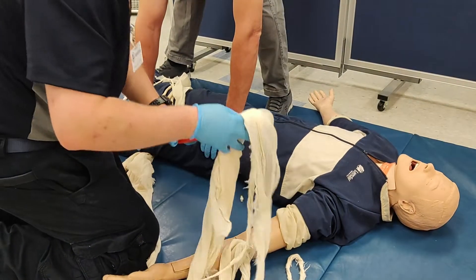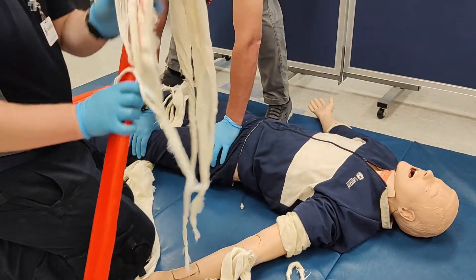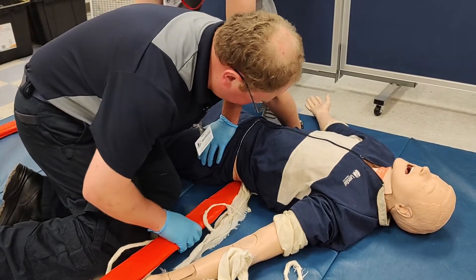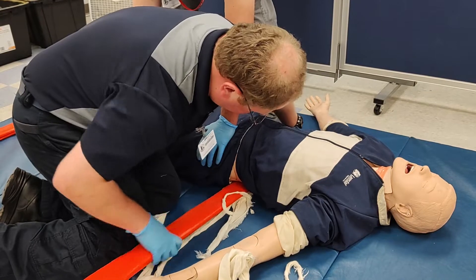This can be either accomplished directly, or if possible, using one of the splints as a tool to put the cravats underneath.